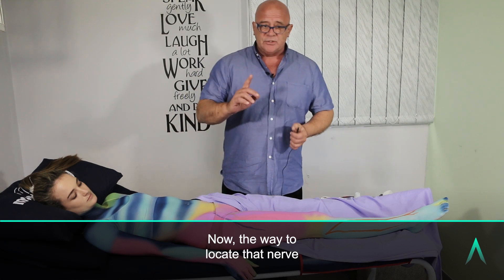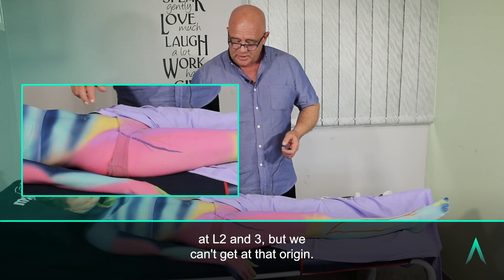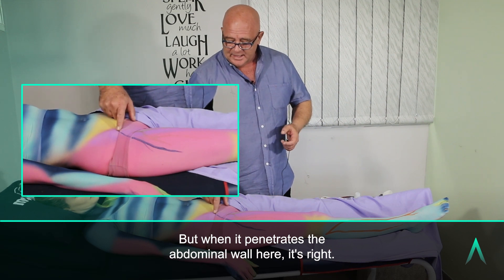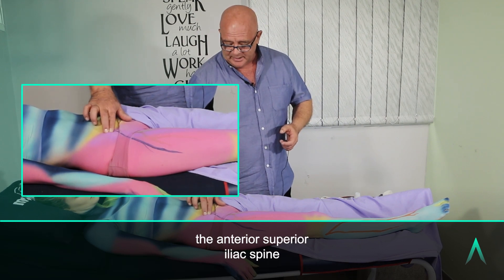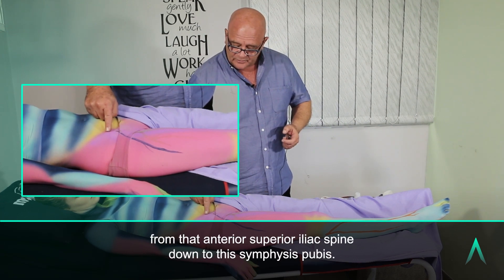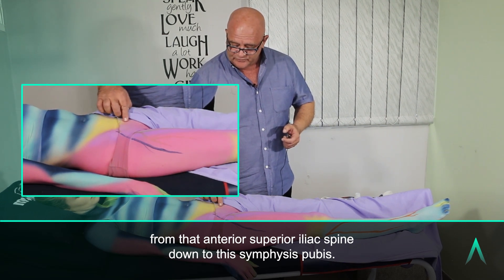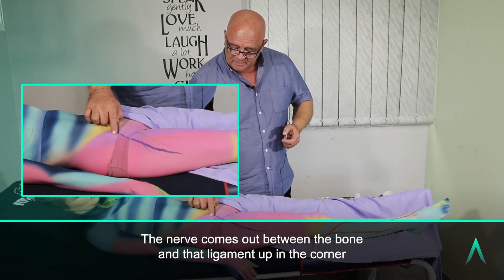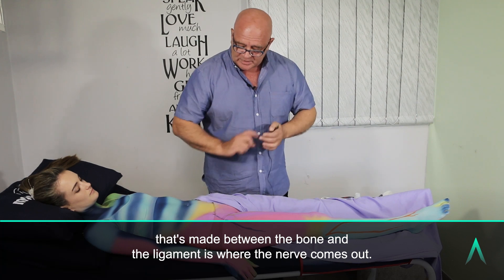The way to locate that nerve at its origins — well, its origins are right in the spine at L2 and L3, but we can't get it at that origin. When it penetrates the abdominal wall, you first identify the anterior superior iliac spine, which is this little bit of bone here. The inguinal ligament runs from that anterior superior iliac spine down to the symphysis pubis. The nerve comes out in the corner made between the bone and that ligament — that's where the nerve comes out.